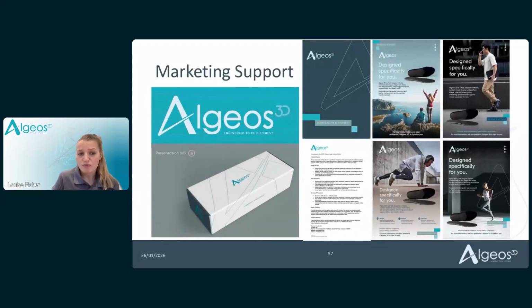We offer marketing support. So it's not just about the product, it's all about the brand of Algeos 3D and what it offers. And with that, you can see there's the packaging solution that comes with the product. There are QR codes for patient information leaflets, and there are lots of digital systems such as branding for your clinic, branding that you can use on your website and your socials, and lots of promotion tools that you can use to market this as a product as part of your business offering.